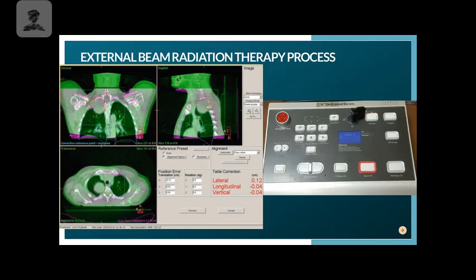Things that we want to look at, and I can zoom in here a little bit so you can see. All of the structures that we care about, this is your aorta, and I'm going to get a different color because green over green is not helpful, right? So this is your aorta right here. That is one big structure we can look at. We have up here where our sternum meets our clavicles.